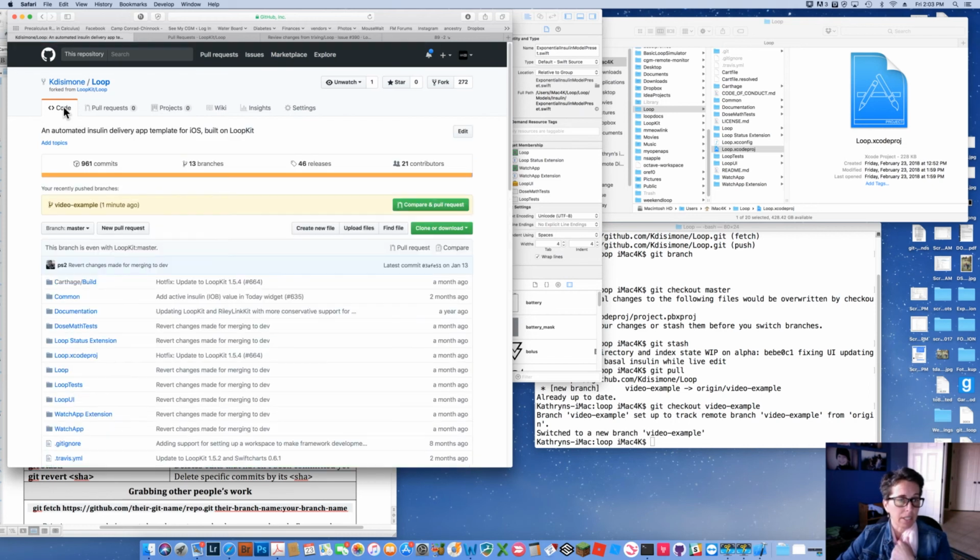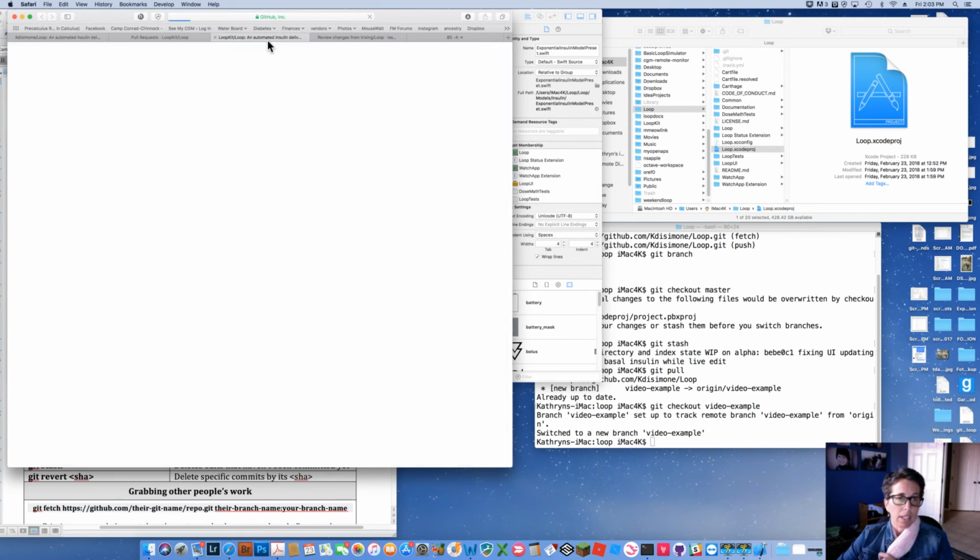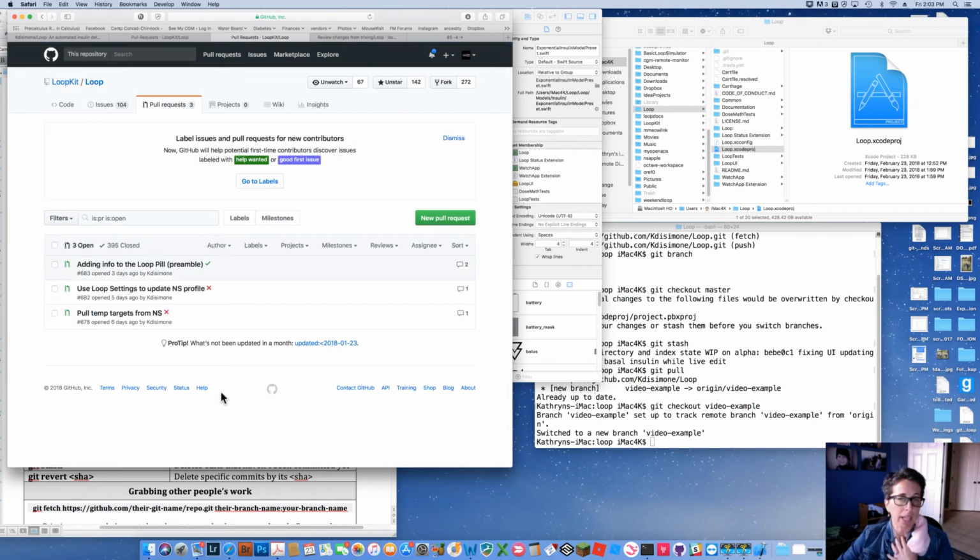I have done some recent commits to specialize and customize my Loop compared to what the default Loop settings are, beyond what the customizations in the Loop docs talk about. I've done some pull requests to the main Loop branch, for example. I can look, these are the pull requests. Some of my customizations I think other people might want. I have not coded these. I've had the wonderful help of other people who are smarter than me to do some code work to get these requests done. They may not be up to standards of the developers, and so these are sitting there waiting for feedback from Pete or whoever about how they could be better.